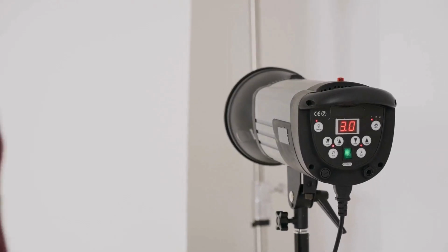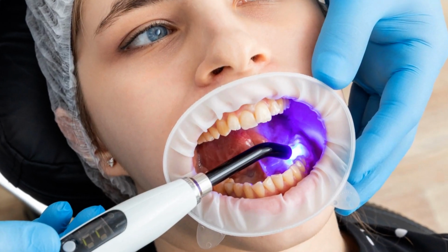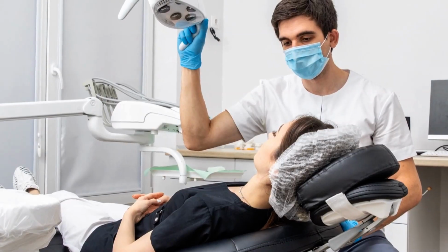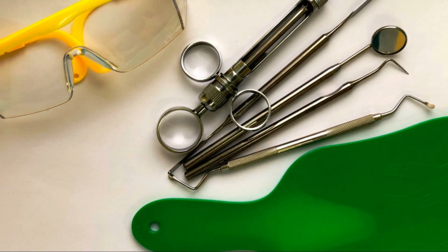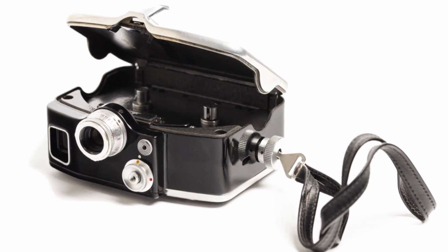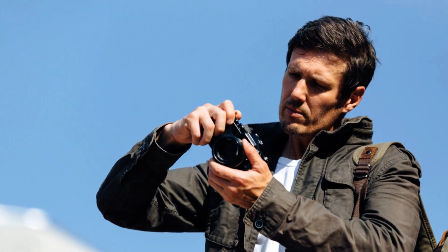Once the equipment is in place, the setup process is simple. The polarizing filter on the light source is rotated until it is perpendicular to the filter on the camera lens. This alignment ensures that only light waves that have been twisted by the dental structures can pass through, effectively eliminating glare and specular reflections. The camera settings, such as aperture, shutter speed, and ISO, are then adjusted to achieve optimal exposure and depth of field, ensuring sharp, well-lit images.